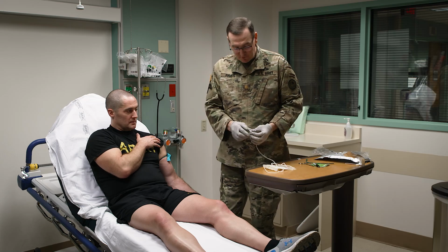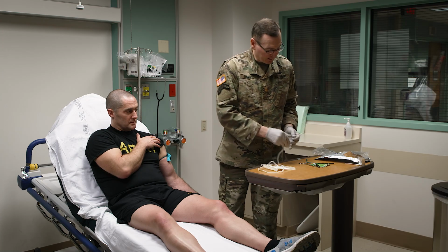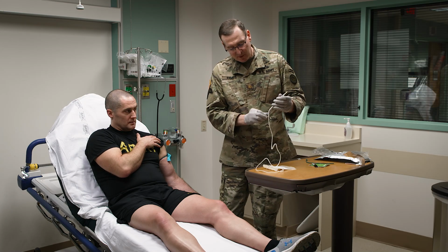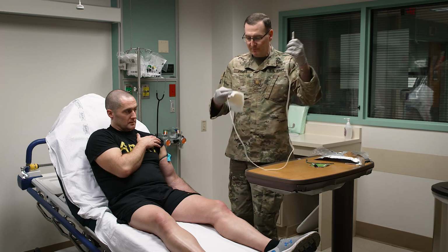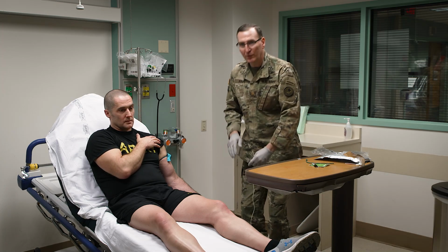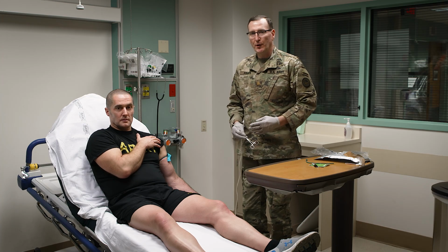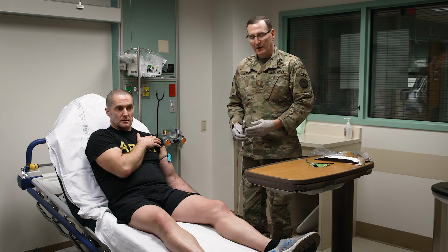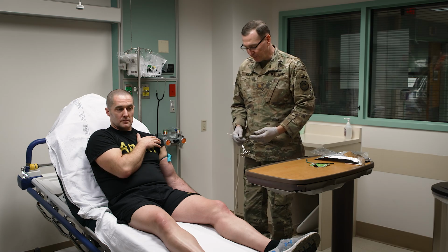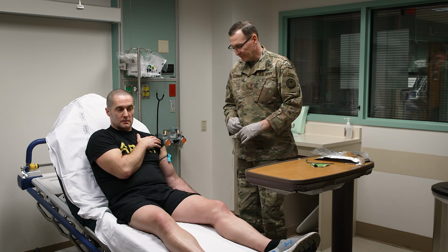Once your chlorhexidine or whatever antiseptic that you use is applied, go ahead and place a clamp just a few inches below the needle here. You want to take your bag and make sure it is appropriately placed below the patient's heart. In this situation, we're going to place it onto the floor. That is an appropriate place in the pre-hospital setting. So don't feel that it is an unsanitary technique to place the blood collection bag on the ground or in the dirt, wherever you may be.